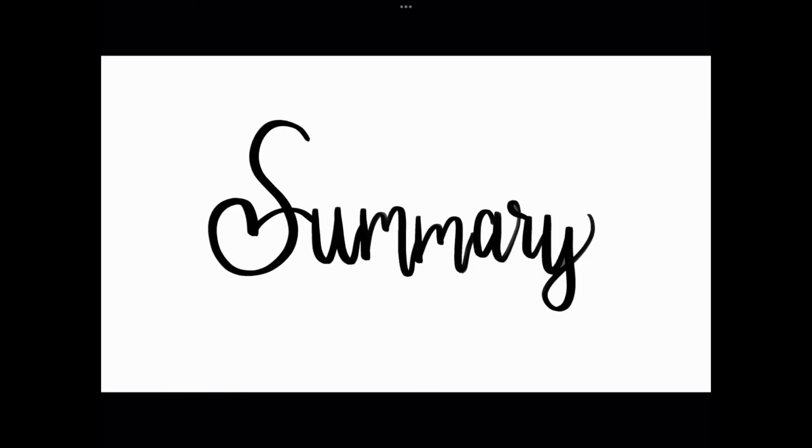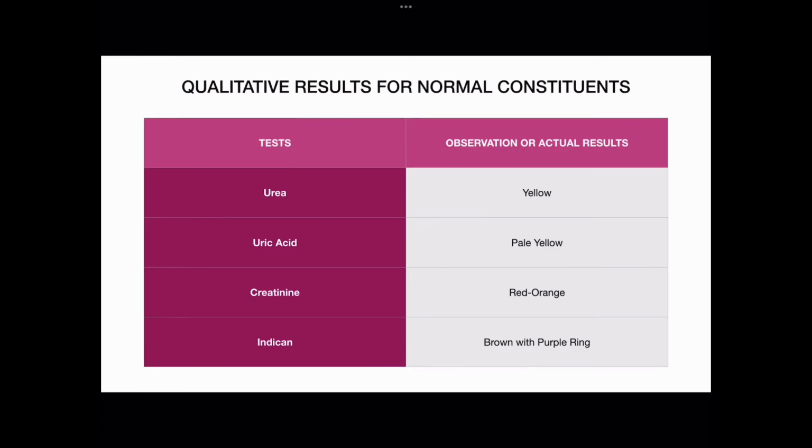That's all. Good morning. I am Jam, here to present the results of our urinalysis tests. These results have two parts: the results of the normal constituents and the results of the pathological constituents. Let's go to the first one, the qualitative results for normal constituents. The tests include the urea test, uric acid test, creatinine test, and indican test.